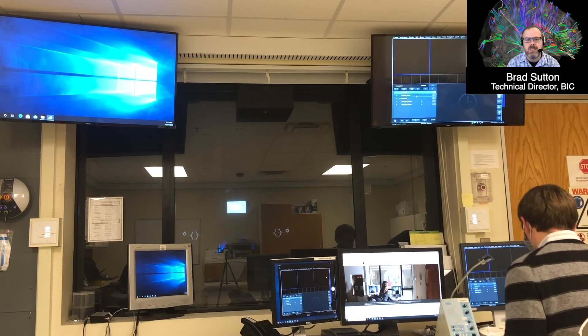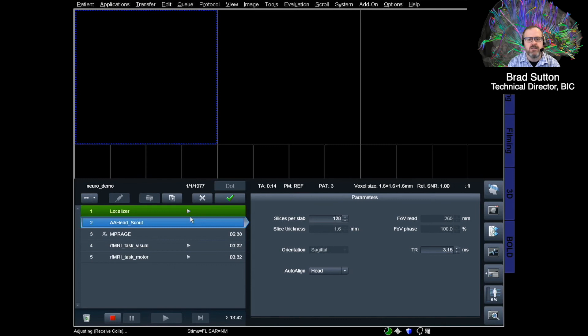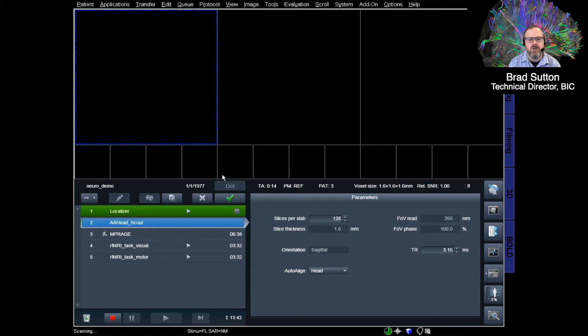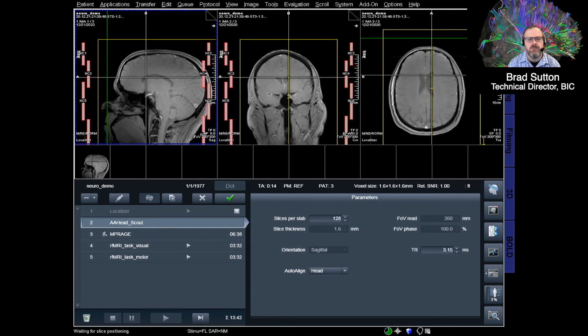Aaron is going to the console to run the scanner. The first scan is just a localizer — it allows us to see where the brain is positioned in the scanner so we can prescribe slices to image the right parts of the brain. This first scan runs very quickly and pops up images showing three different views of the brain: one from the top down, one from the side, and one from the front.